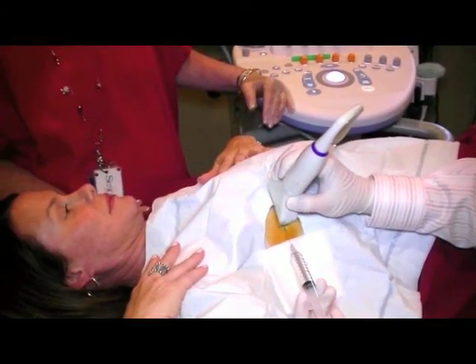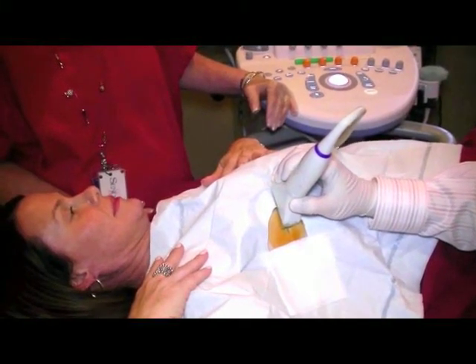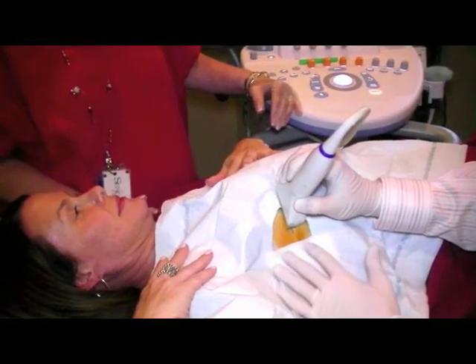During a core biopsy procedure, a tiny incision is then made in the skin and a biopsy device is advanced to the region of concern. Multiple biopsy samples are obtained. Please let me know if you experience any discomfort during the procedure, as additional numbing medicine can be given if needed.